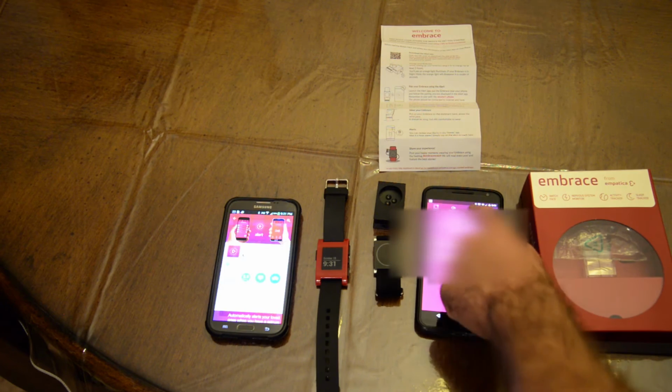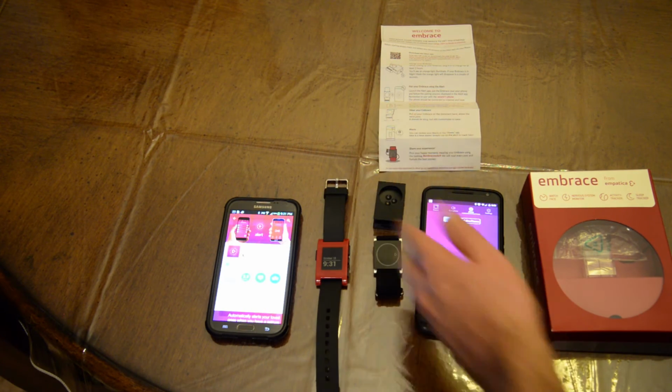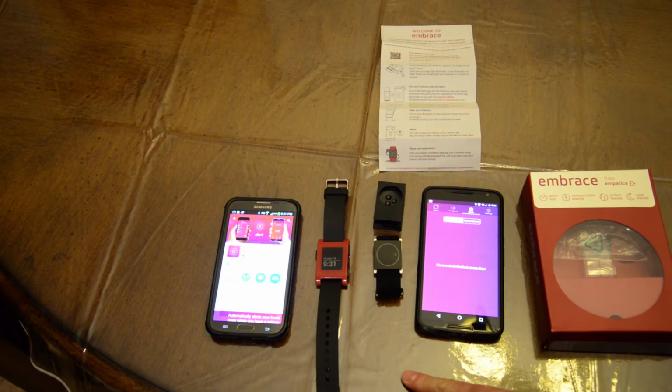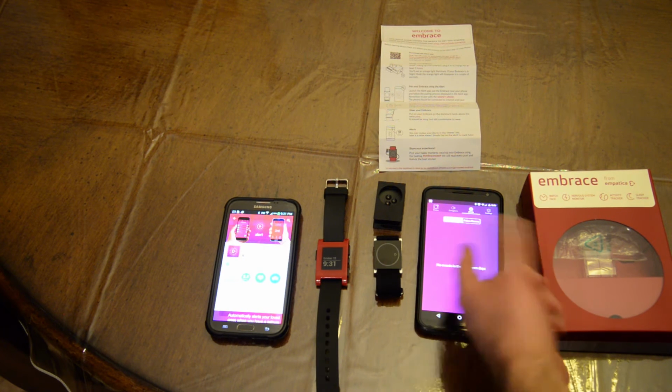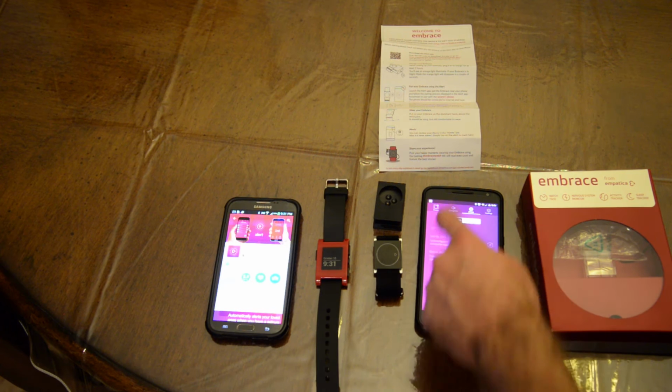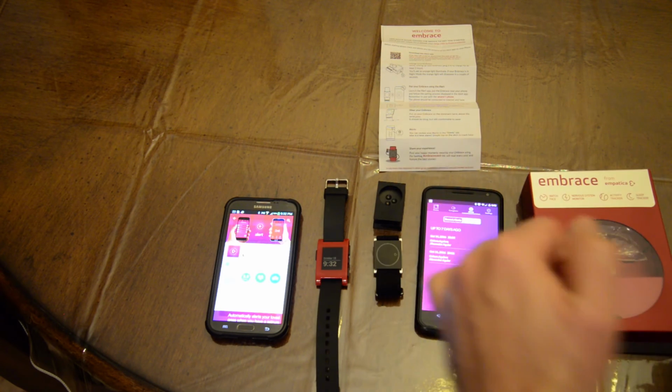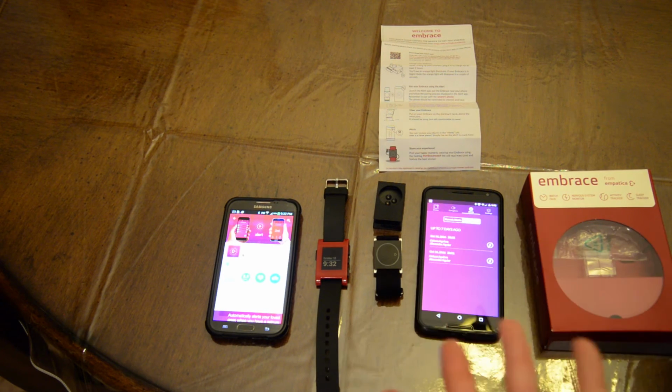This is interesting because under alerts, you would have recent alerts, as I told you earlier. My son didn't have any seizures this weekend, thank God. But we did test it, so we gave false alarms by just having the watch on him for about 30 minutes. He tends to move around a lot. He shakes a lot, which could mimic seizures, because not only does he shake and move around this much, but he also gets very excited.